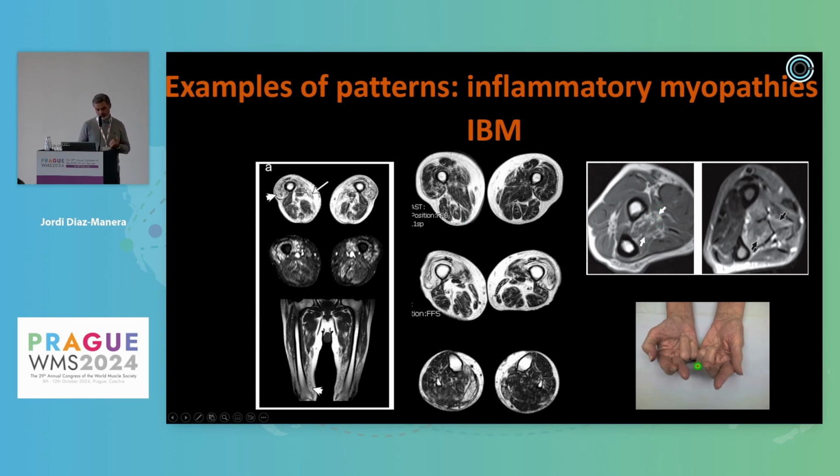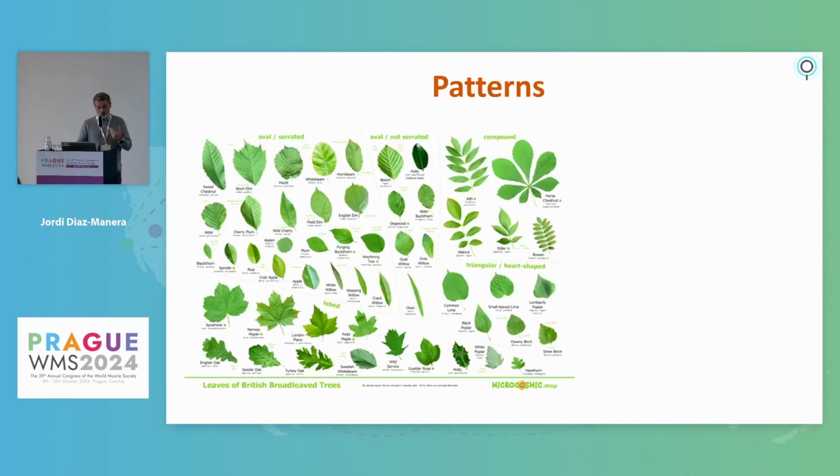And this is just to show you that we have, Benedict was talking before about the flexor finger weakness of these patients, that of course has a counterpart in the MRI, and you can see a fat involvement of these muscles in the arms. So good.